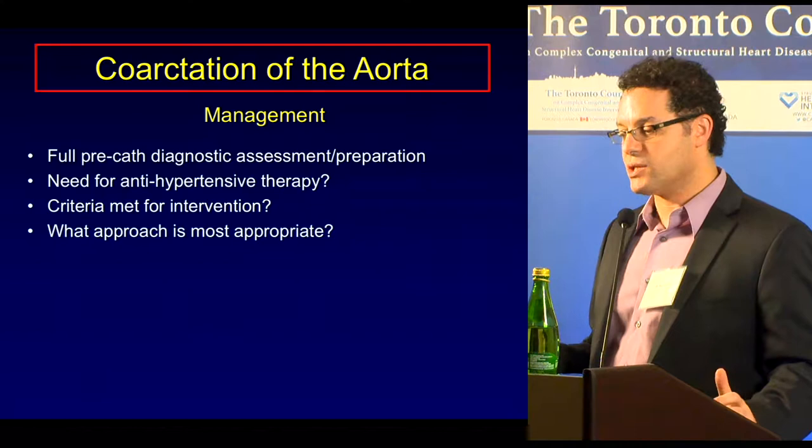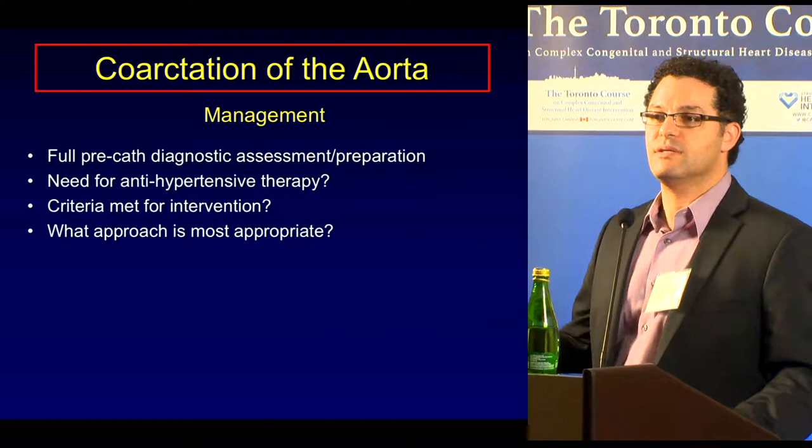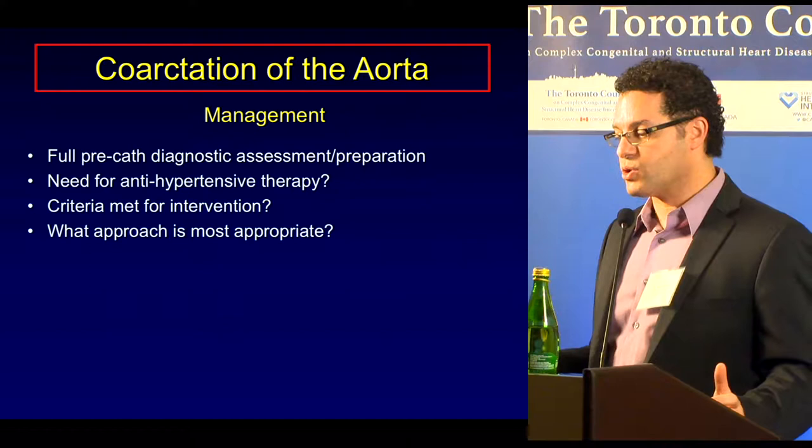So then management. Before you come and do this, you're going to need to do a full pre-cath diagnostic assessment and preparation. Are there concerns about their coronaries? Do they need antihypertensive therapy to get them safely to the cath lab? Have they met the criteria for intervention? And then what approach is the most appropriate?